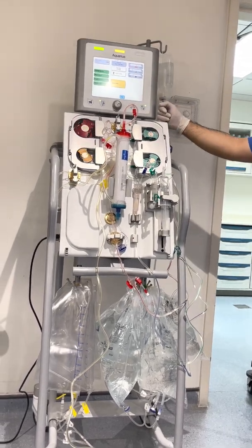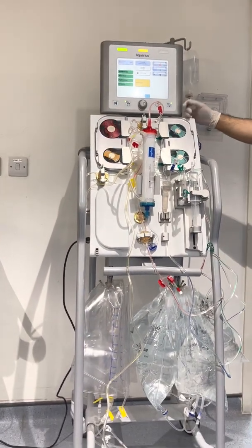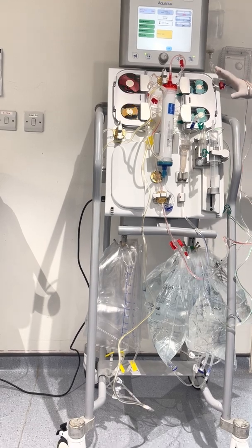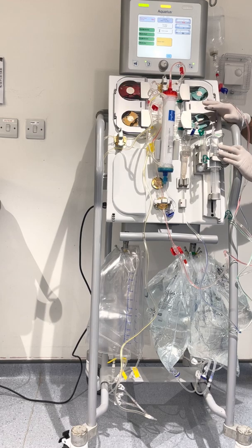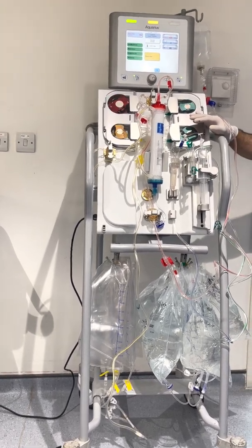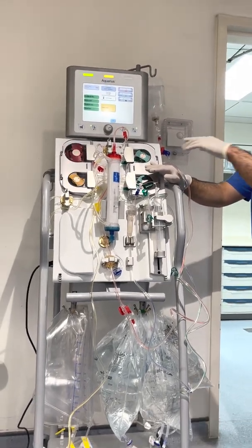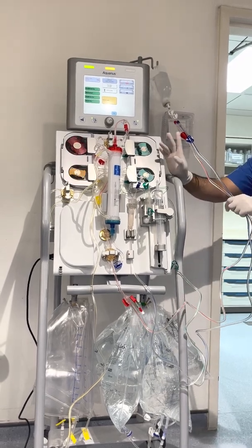1 minute. So after this one, we have the clamp test. So the machine will measure or test the blood lines if there's a leak. So that's the next test for this. After this one, it takes time. Second test. That's the second test. First one is the priming, then the second test is the clamp test. After that one, it's already passed.